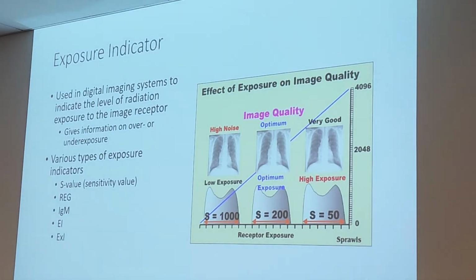So when you start working and they're training you, the first thing you should do is learn the buttons on your equipment, and then also learn your exposure indicators. Know what the correct ranges are, so you can tell if you are overexposing, underexposing, or optimally exposing. Good? All right, great.